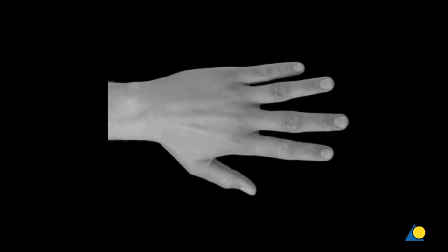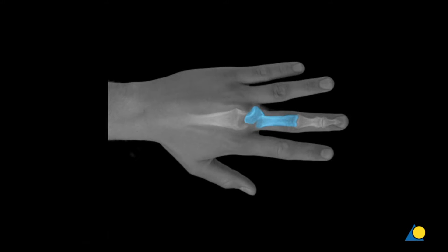The approach is shown on the proximal phalanx of the middle finger but is identical for all long fingers. A curved skin incision is made on the ulnar or radial side dorsally over the metacarpophalangeal or MCP joint and is extended longitudinally in the midline onto the dorsal surface of the proximal phalanx.